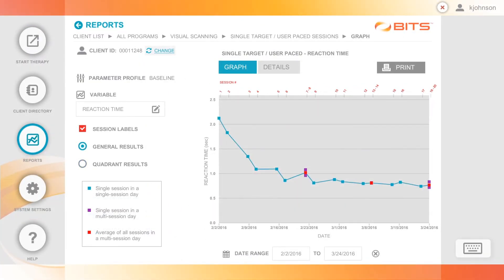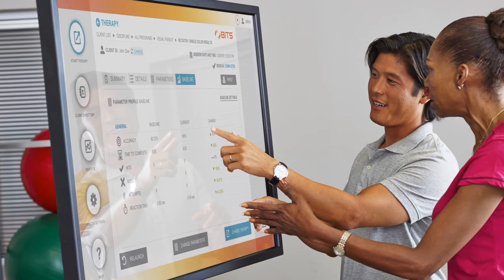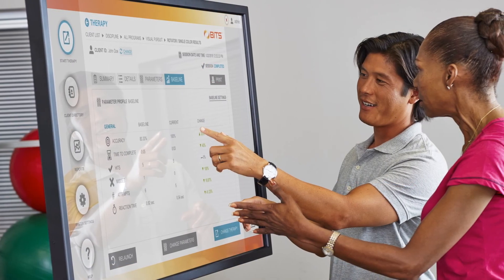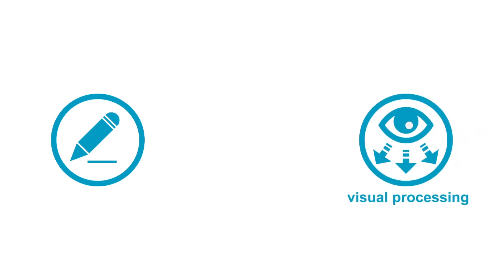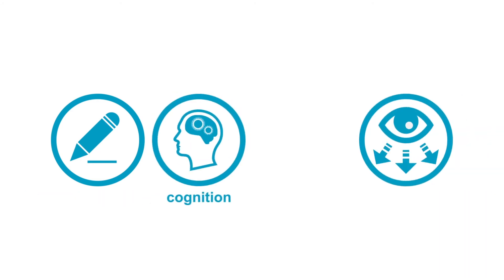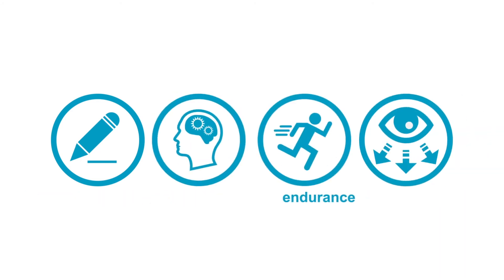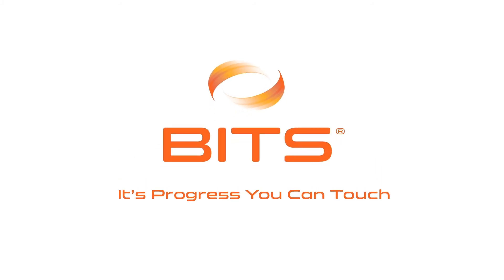BITS is designed to motivate patients and improve clinician efficiency with diverse program options that challenge visual motor skills, visual processing, cognition, and overall endurance. It's progress you can touch.